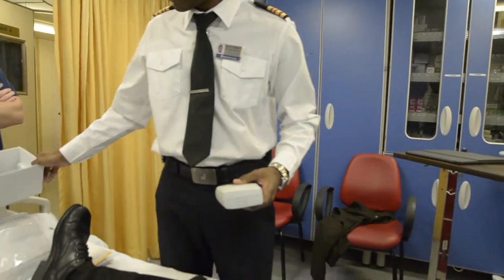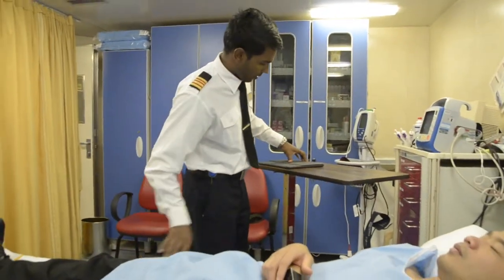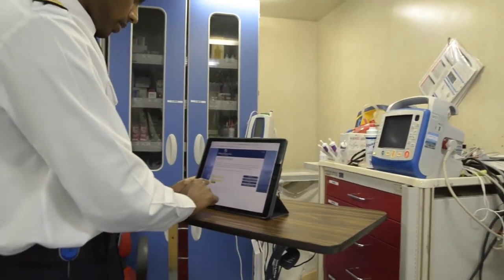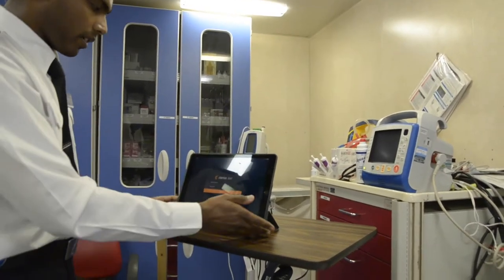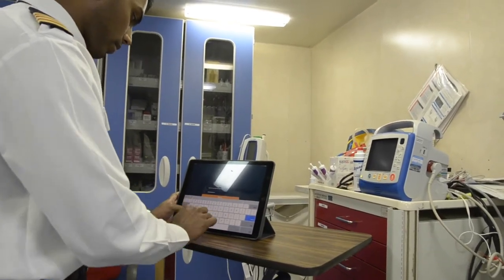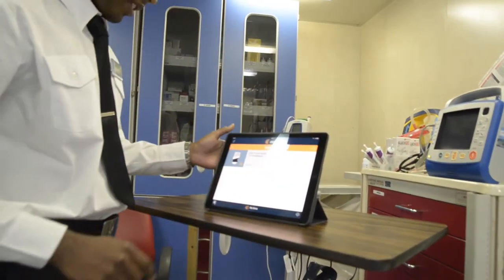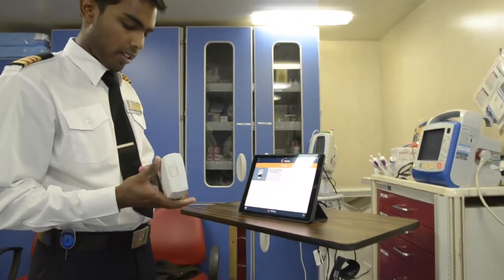Let's see if this is as simple as they say it is. First, you need the app on your iPad. Let's start our internet, login, then go to the Clarius app, and type in our password. Okay, there we go — that was simple enough.